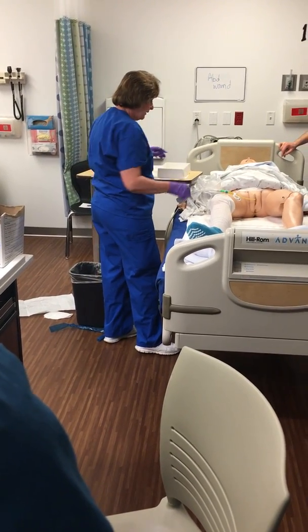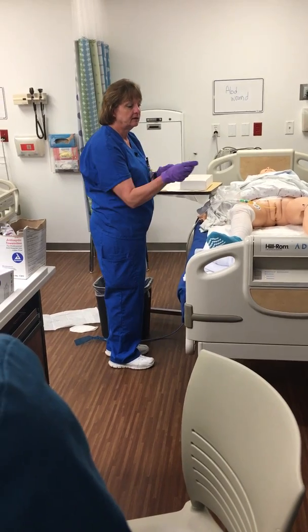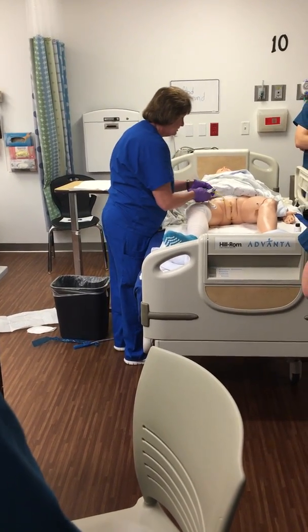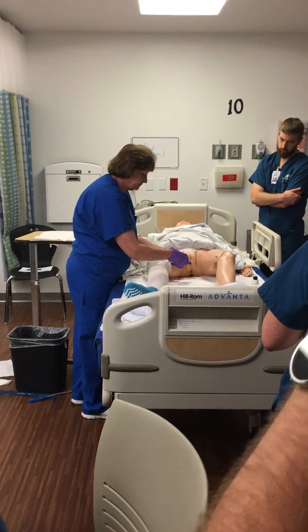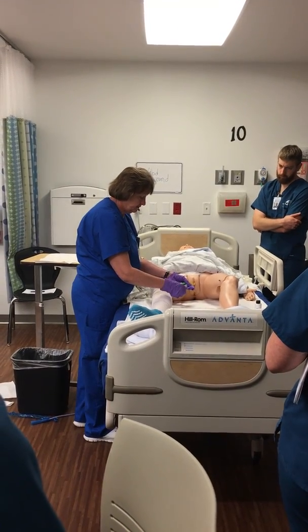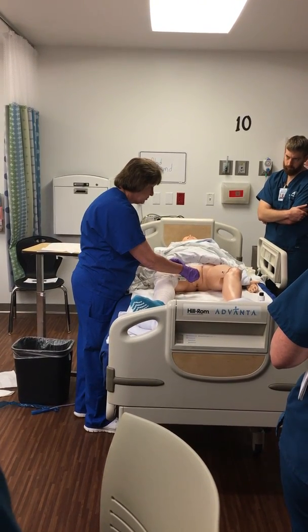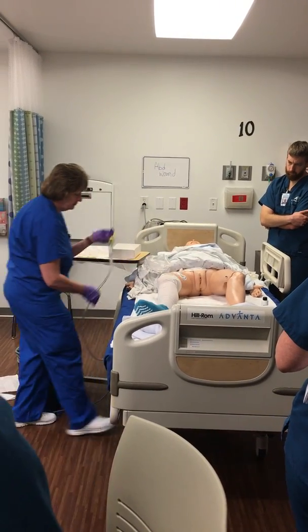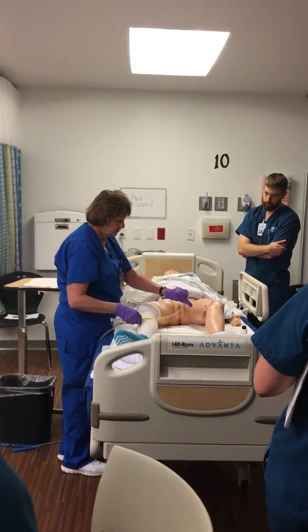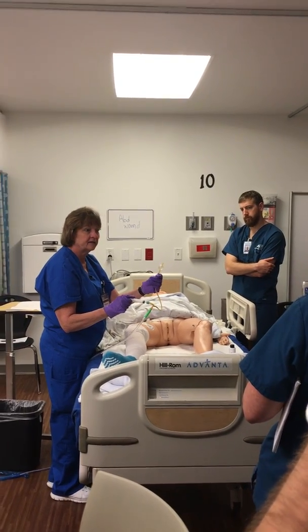So that's placing that in. Now I have to remove the catheter. So I'm going to put on clean gloves and I'm going to have a needleless 10-milliliter syringe. I'll look to see how much they had put — almost everybody always puts 10 milliliters and just fills the whole thing up. Then I'm going to attach this again here and pull back until I don't get any more, and it should be right at 10. Then I'm going to ask you to take a couple deep breaths — same thing when placing in the catheter — just take a couple deep breaths, and then I'm just going to take it out. So the catheter itself, when you fill up the balloon, this is what it looks like, and it keeps it in place.